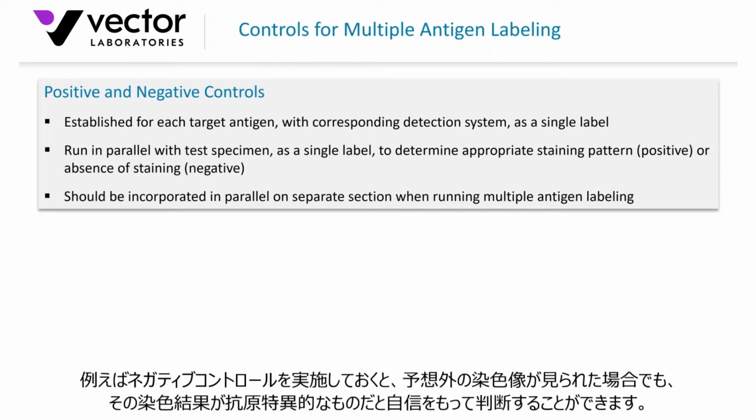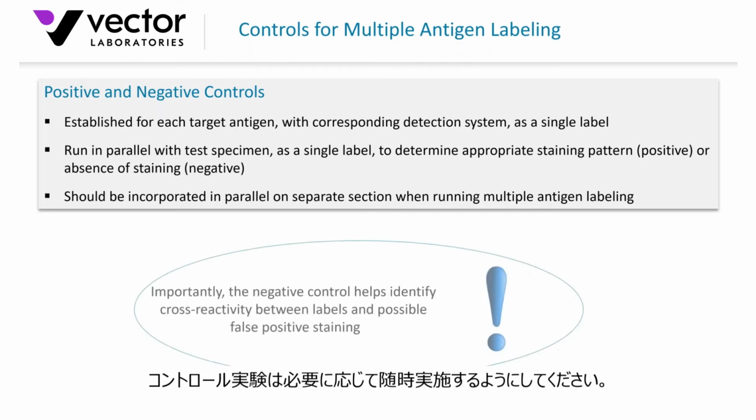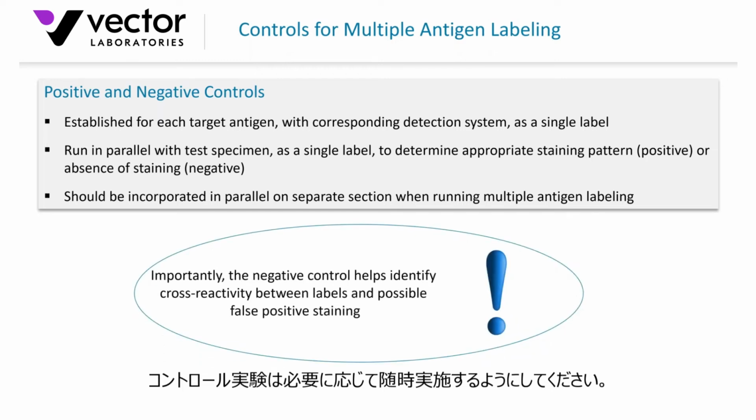Instead of scratching your head thinking, I'm not sure if that is accurate, you've got these controls in place to help give you confidence that, yes, what I'm seeing is a novel observation, and you can move forward with that observation. Make sure you can repeat it, obviously several times, but nonetheless, it hopefully underscores why you should introduce these controls in your system.